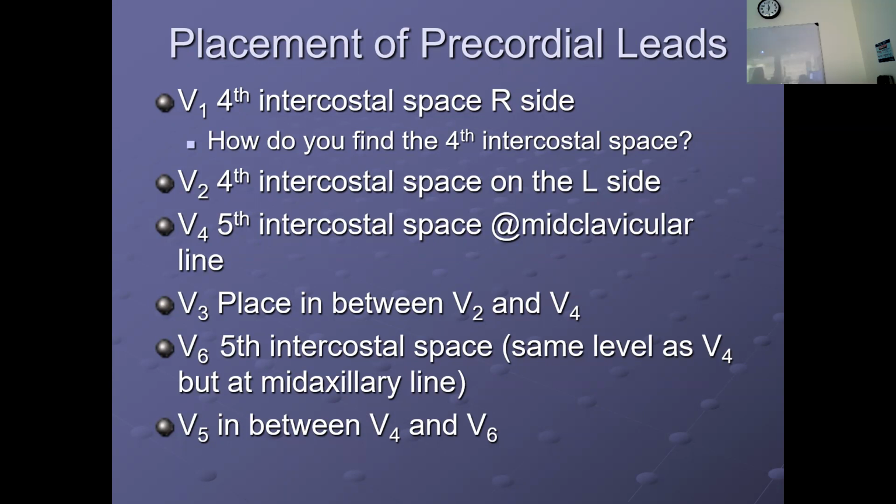So when guys are doing a 12-lead EKG on a female, you have to be really careful how you place the lead. You don't want to get accused of anything. So of course you'll have gloves on. You're going to use your hand, and you're going to move breast tissue away with the back of your hand to place your V4.